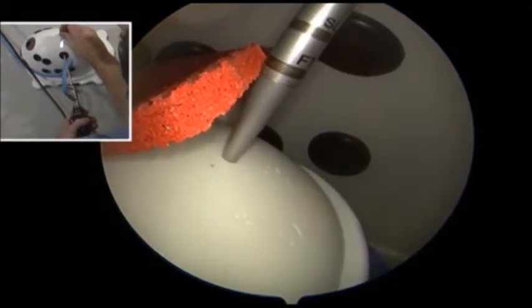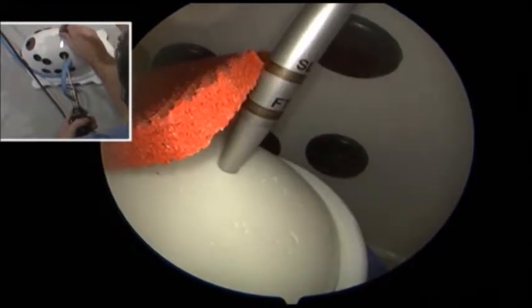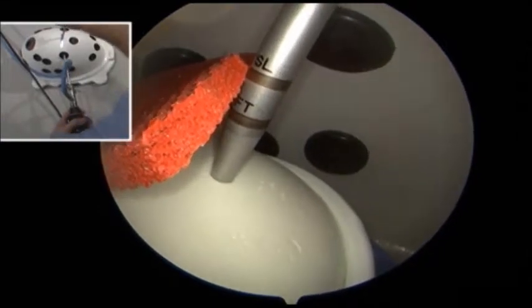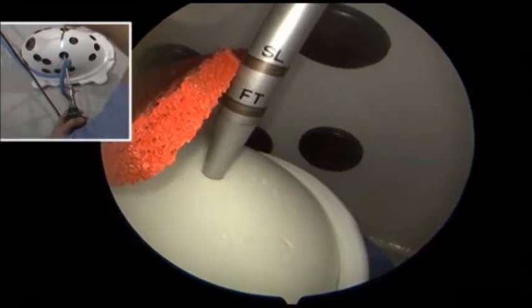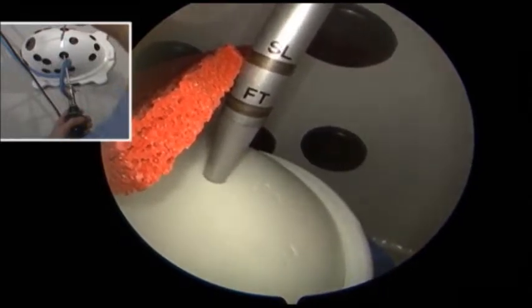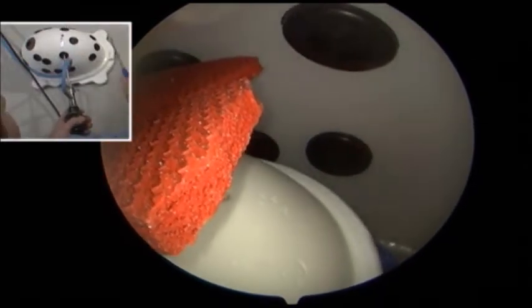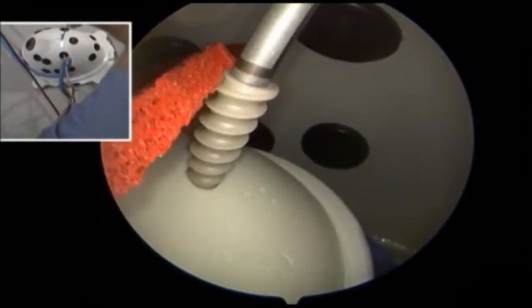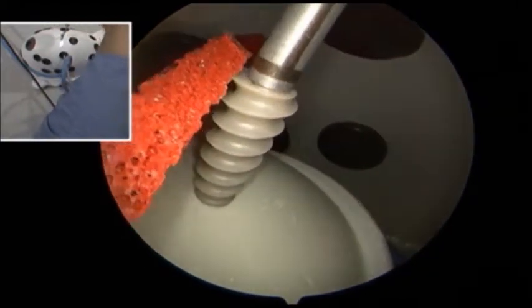If you don't have an assistant, you can also do this using the IPEVO camera. For this, we're simulating osteoporotic bone, so we're not going to drive it directly to the laser line. However, in somebody that had very good bone, you would put this all the way to the laser line. Place the anchor in at the same trajectory.